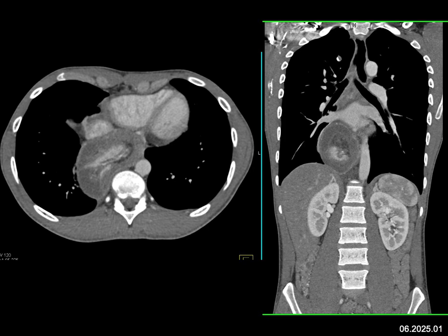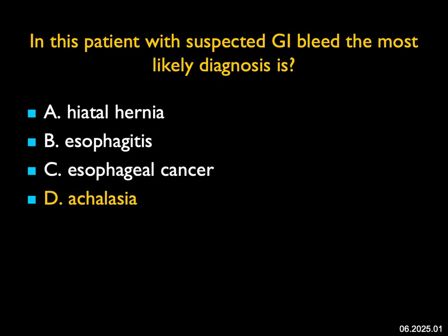Markedly dilated esophagus, smooth borders, and the high density in the lumen is bleeding. This was a patient who bled who had achalasia. A really nice example.